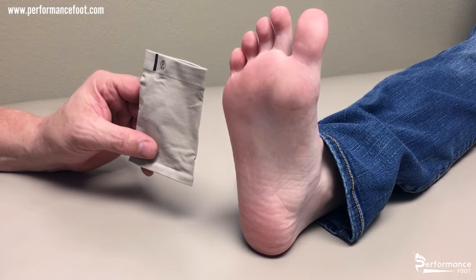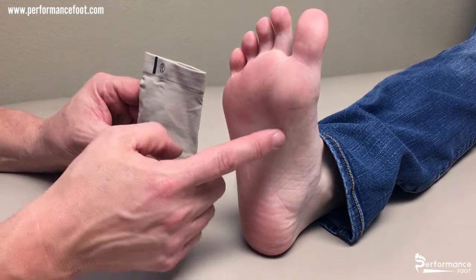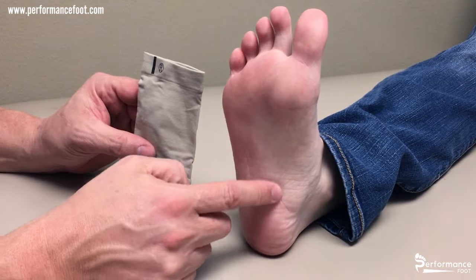This is a plantar fasciitis arch sleeve. It's used to relieve pain and tenderness throughout the arch.